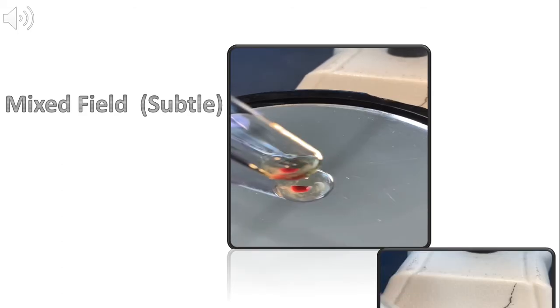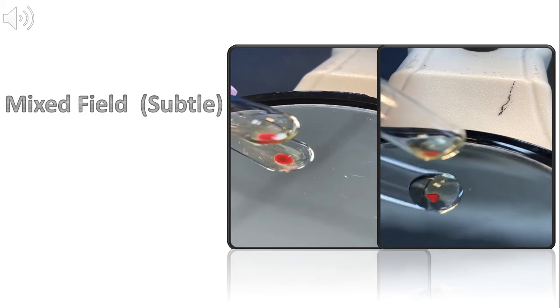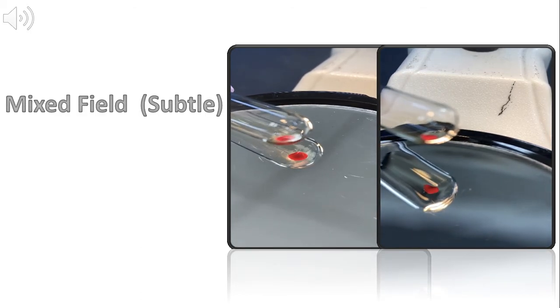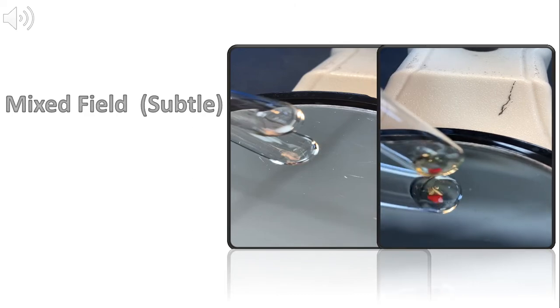For comparison, the video on the right has no mixed field present. The video on the left has subtle mixed field. As an example of when this may occur is a patient who has been transfused several weeks ago and therefore patient cells predominate while donor cells are minimal.